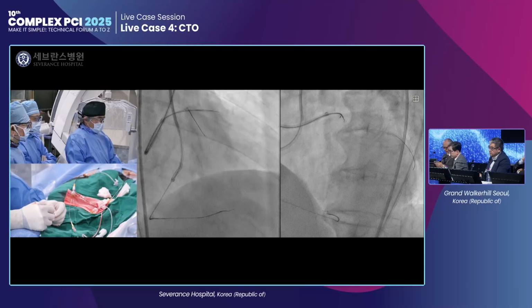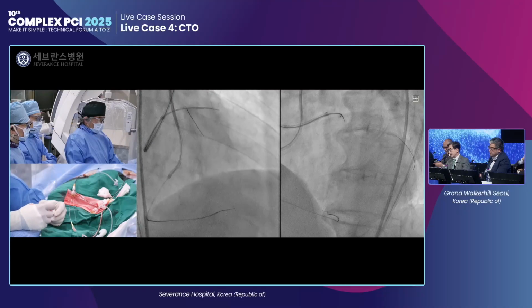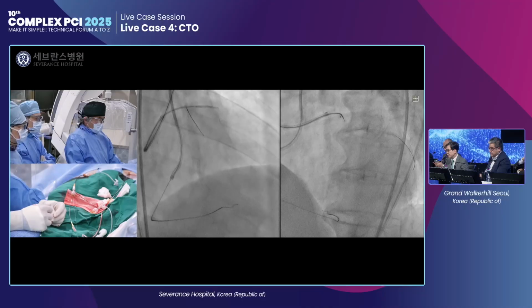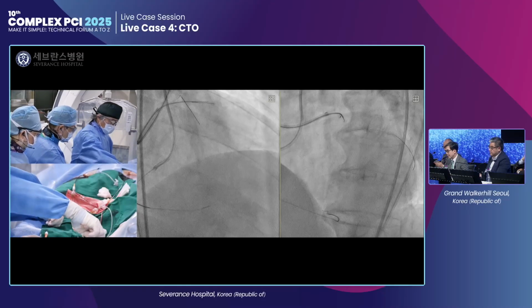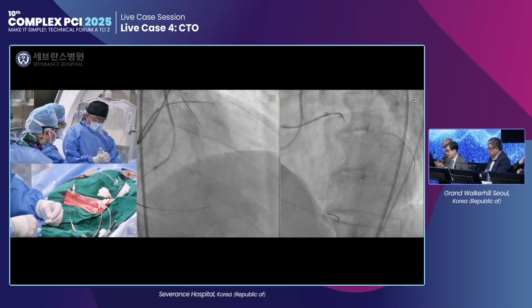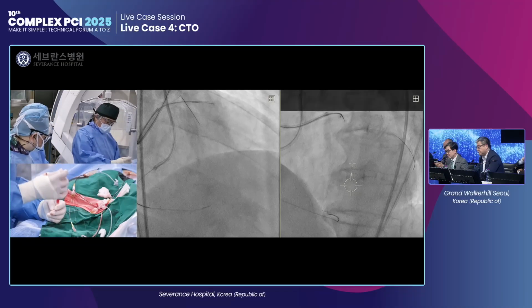Angiogram of septal channels is always misleading. As my personal habit, I do a tip angio at least at 3 different angles and analyze it in 3D. That is a good tip to avoid being misled by overlapped fine microchannels.